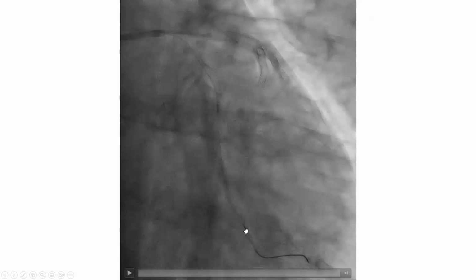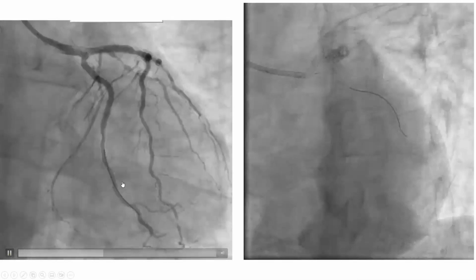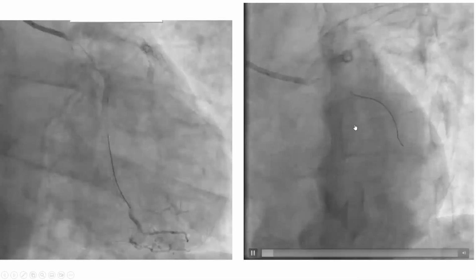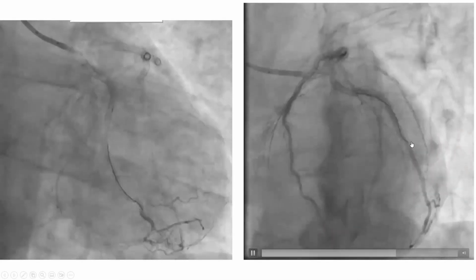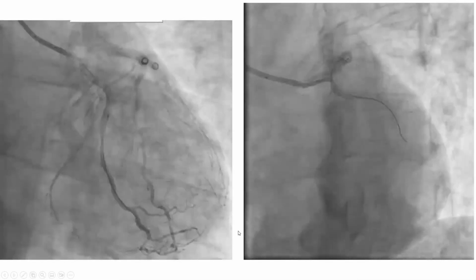Another thing you can do with that dual lumen catheter once you see no reflow is administer a distal coronary vasodilator through that microcatheter. And we did in this case. You can administer verapamil or nipride through that catheter, and that will improve the no reflow. But the biggest issue was stenting proximally in this case. And that's what was done, and he had a good result. And for the no reflow, we used distal vasodilator, and we gave integrilin as well.